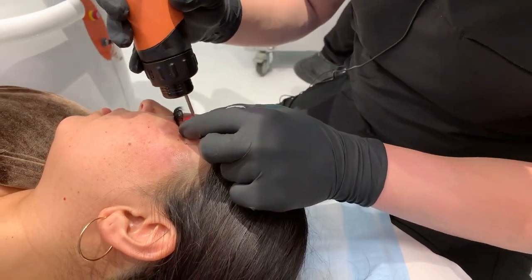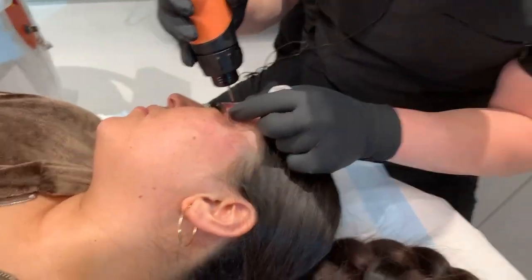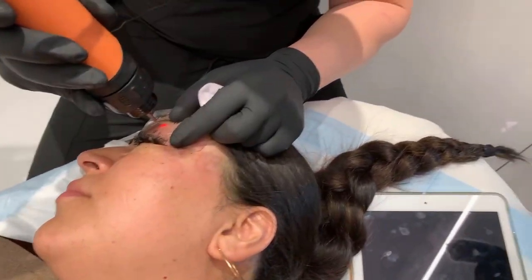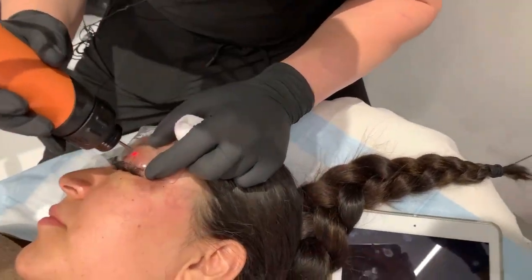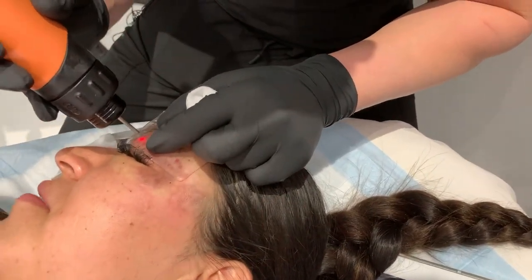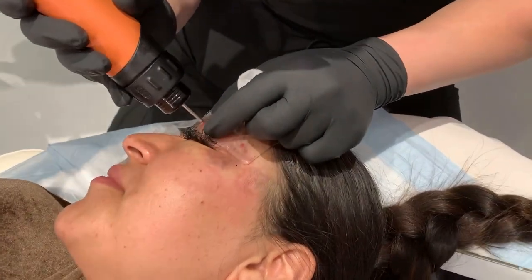What would happen, you guys, if I hit her hair? Anyone know? It would fry. No, not with this laser. Now with this one, it takes black and turns it to white. Her hair would turn to like a Disney princess that's gotten shocked by a witch. Can you do my roots? Yeah, we could do your roots with it. Perfect. We'll give you the platinum look.